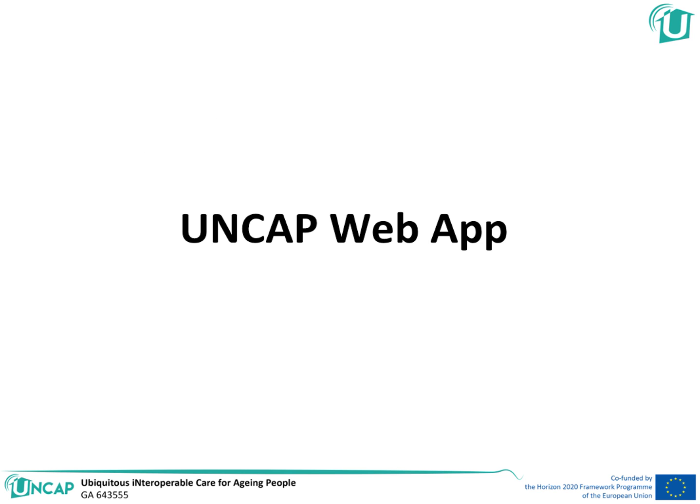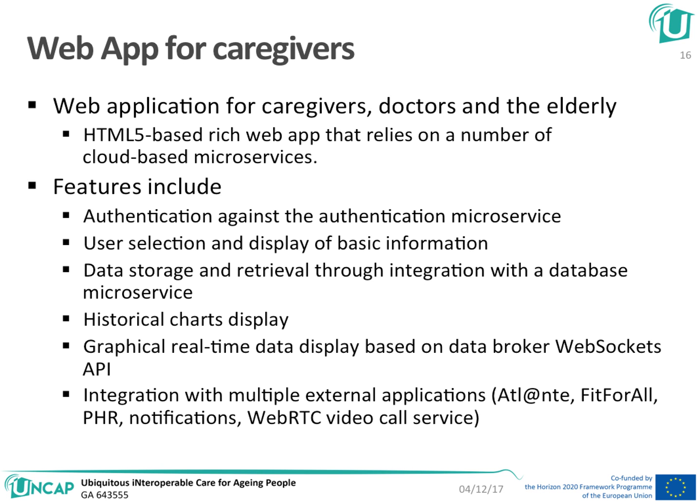Now another big piece on the other side, on the caregiver side, is the Uncap web application. This one of course can be used by caregivers, doctors, or even the elderly or the next of kin. It's an HTML5 based rich web app that relies on a number of cloud-based microservices for fetching the data, authentication, and so on.